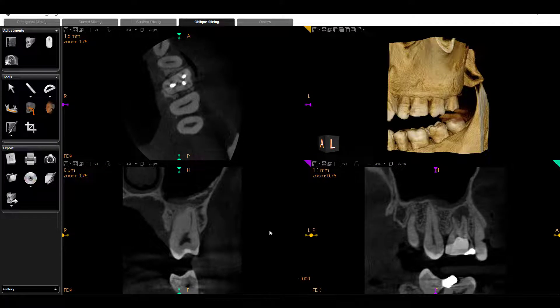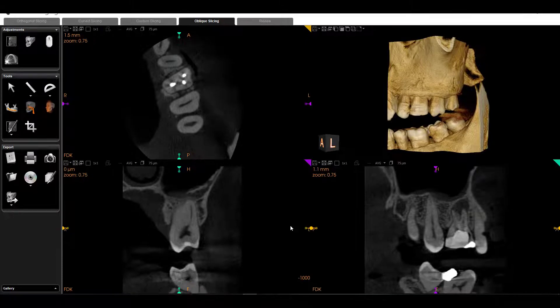This is just one way to manipulate the software — there are other ways, but this is a fairly common way. We're also going to assume we've evaluated the entire scan, and now we're going to focus on the area of interest.